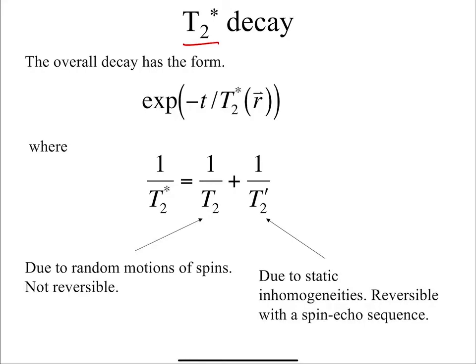And clinically, you just live with whatever you get, because especially in an emergency situation, you're just putting them in. For example, if you talk to the chair of our radiology department, his goal is to have MR exams down to about 10 minutes, where you just put them in and out. Whole body scan in and out. Okay.